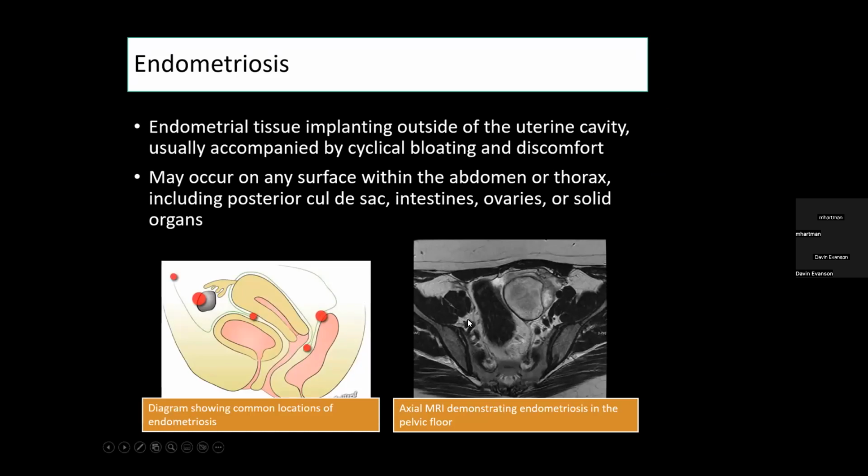Again, you might be looking at this, a pelvic MRI, that's pretty overwhelming. But if you watch the video about how to read a pelvic MRI, the crash course, we'll give you some pearls and get more comfortable with that. But here's a big endometrioma.